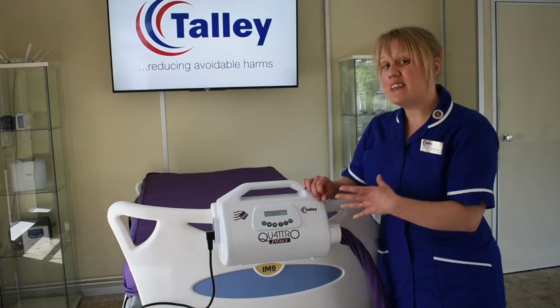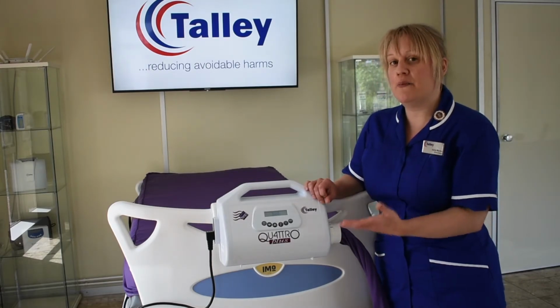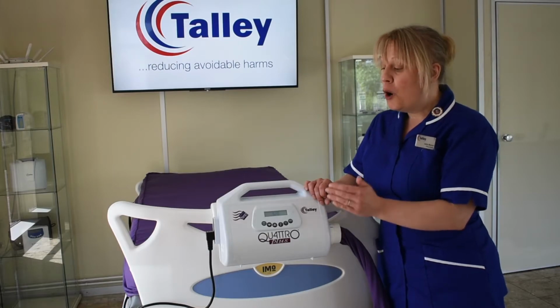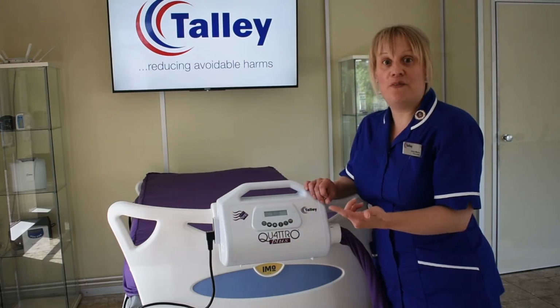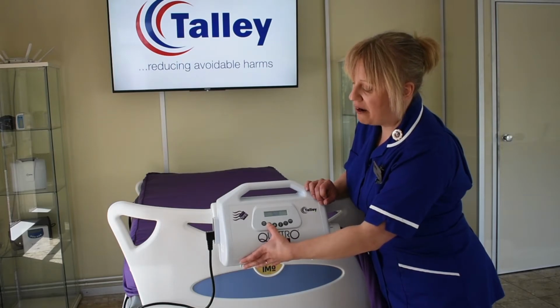Seated is a setting you may use as and when your patient is sat up or profiled in bed, and it just gives them the extra support they need whilst in that seated position. Once they are lying back down again, once they're out of that seated position, we would just change it back to the active soft, medium or firm according to patient preference. So we'll just use the down arrow to come back down to whatever the chosen setting is.